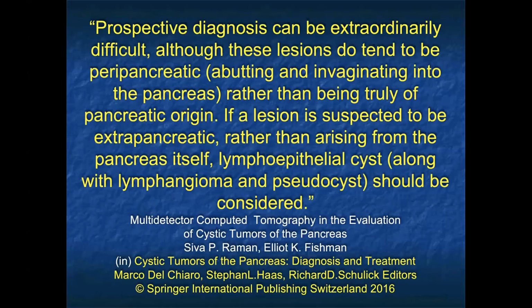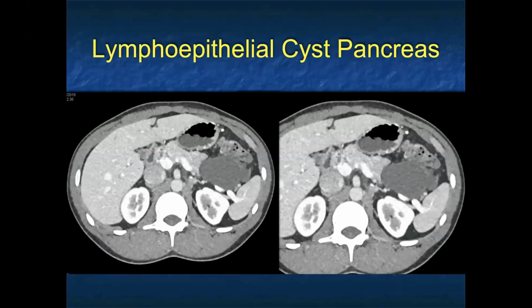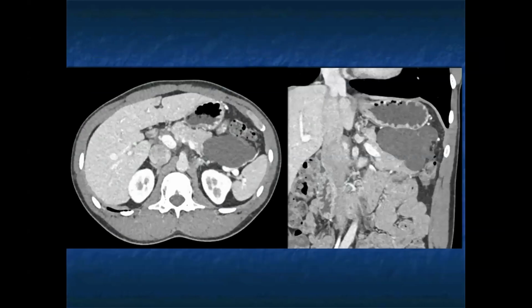So, but we're getting a little bit better because we recognize there's nothing really that sits so exophytic. You look at this lesion, there's a cystic lesion by the tail of the pancreas. You think in your mind quickly, mucinous tumor, serous cystadenoma, lymphoepithelial cyst, large IPMN. When you start looking carefully at the lesion, you can see it's really outside the gland and it scallops the gland.